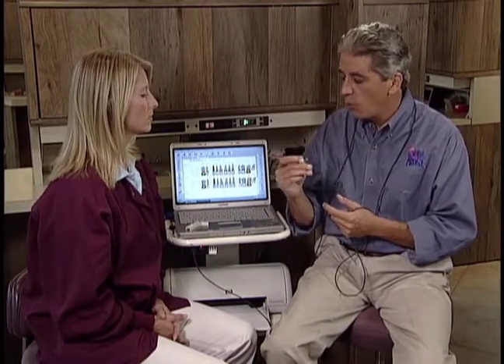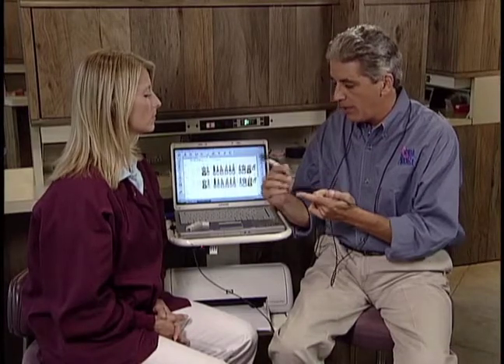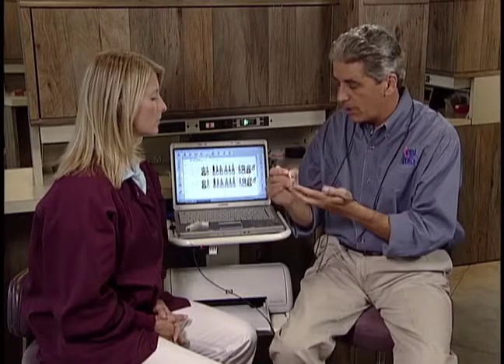That's the second issue relative to patient comfort. Because there's a blue button, it's almost intuitive to pick it up and put your finger on it. I don't want to rest my finger on the blue button because that overrides the 15 grams pressure. Nor do I want to interfere with the travel of that arm, especially as you fulcrum in different manners around the mouth.